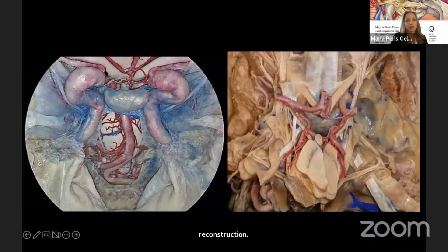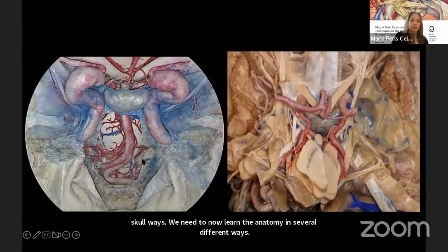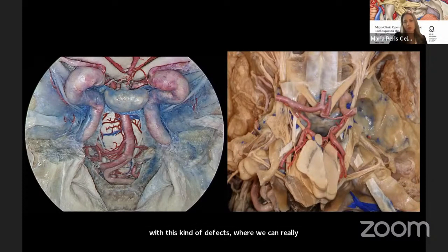Here we see two views of the same anatomy: the endoscopic anatomy on the left and the open anatomy on the right side of the screen. You can see how two very different approaches share the same anatomy — that's the wonderful thing about skull base. We now need to learn the anatomy in several different ways.